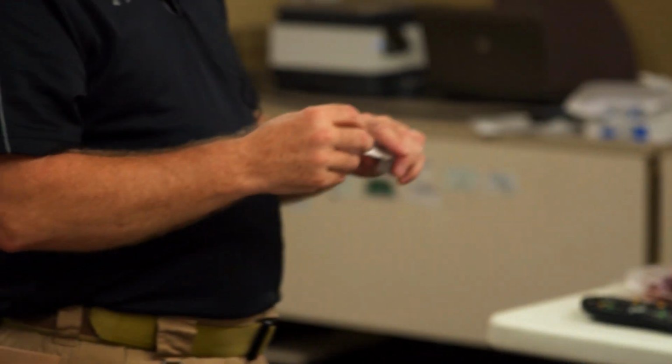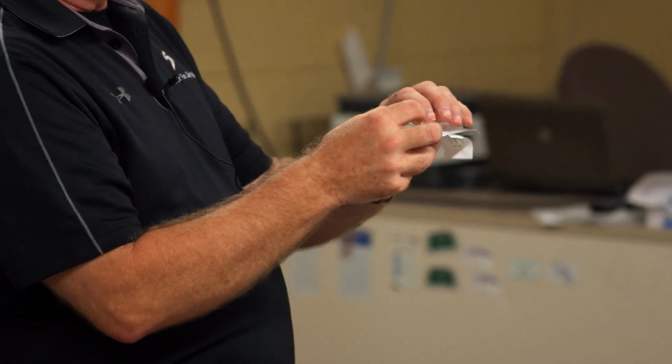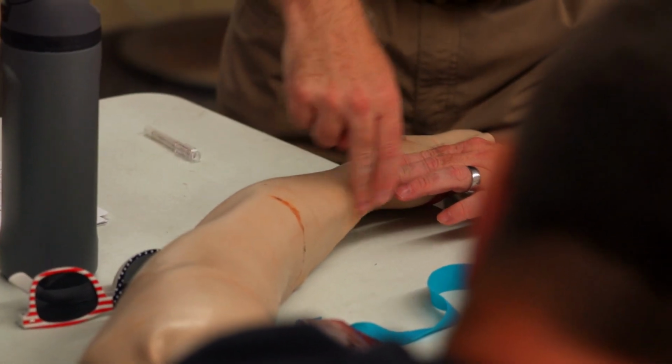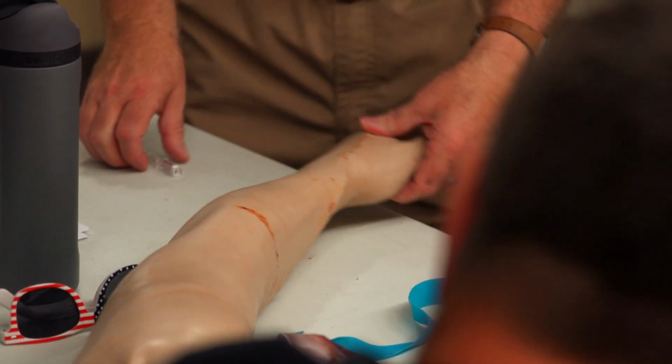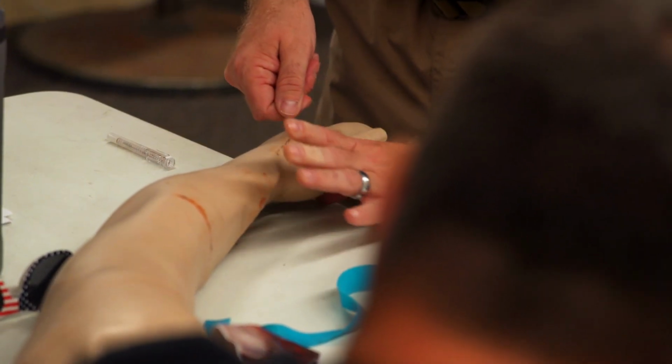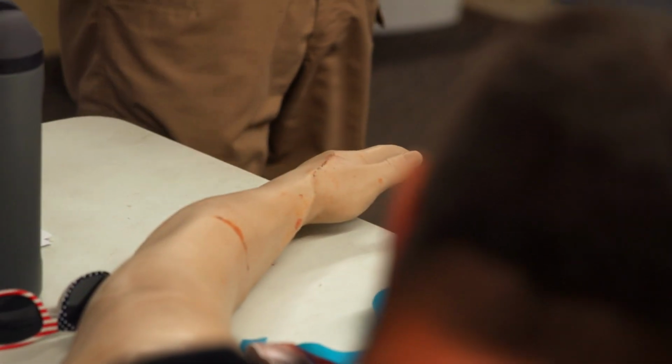Yep, that's great, because I forgot the other step. We do that, but before we retract the needle completely, what we want to do is upstream, you tamponade, you squeeze down. So if we're doing, say, the AC, I'm going in, boom, I'm going to push here, retract my needle. Because I'm stopping the blood flow, I can hook up my stuff, and then I can release it, and we can start flowing stuff. Otherwise, you're pouring blood everywhere. Sometimes it still happens. If you're really fancy, the valve version of these actually has a valve built in that keeps that from happening. It's kind of sweet.